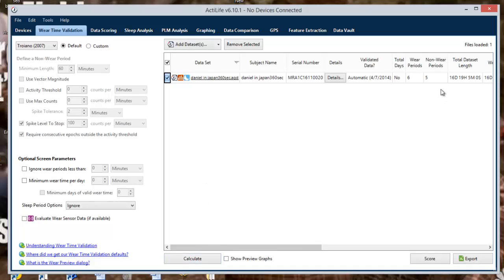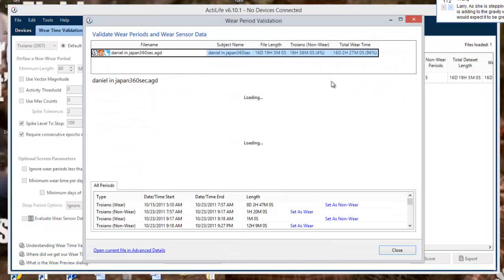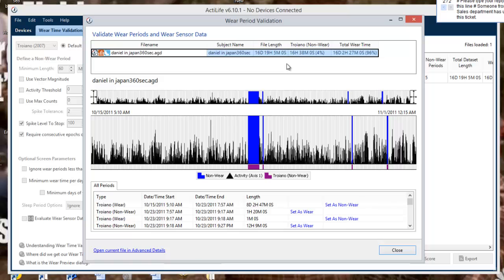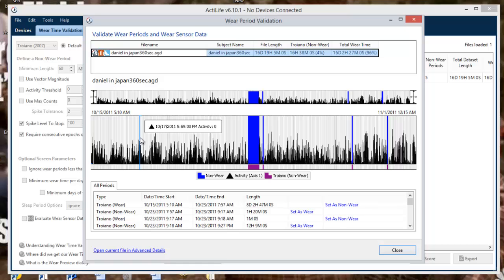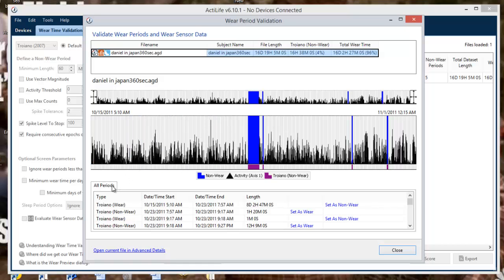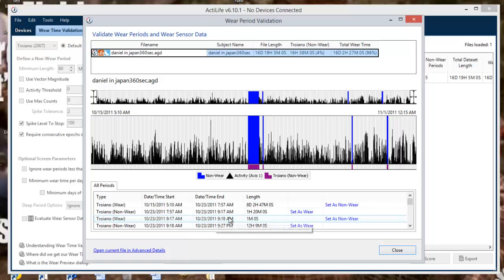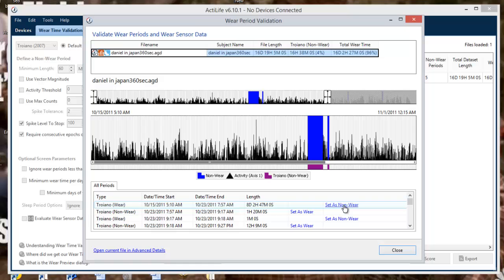Your outputs will now be visible and you can find a complete breakdown by selecting details. When the details option is selected, it will open up a floating window to show the wear and non-wear periods. These periods are represented on the graph and in the all periods box found below. The wear time and non-wear periods can be confirmed or altered by clicking on the blue hyperlink next to each period.